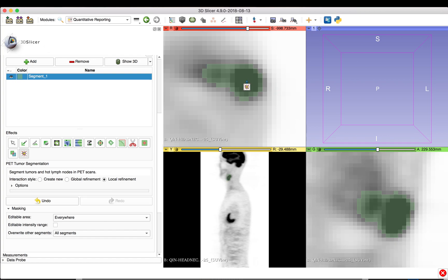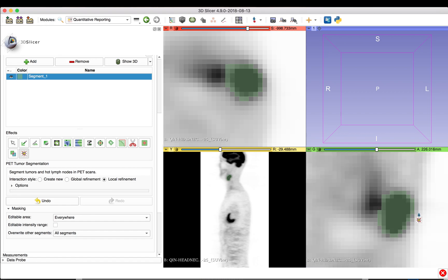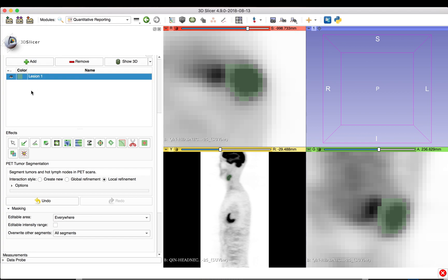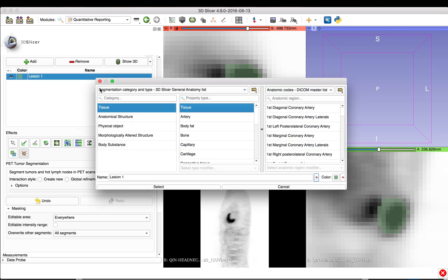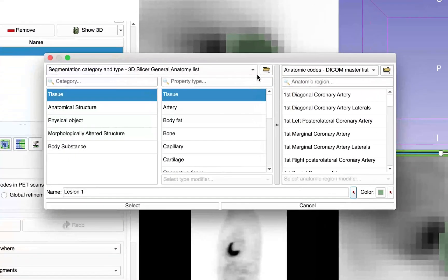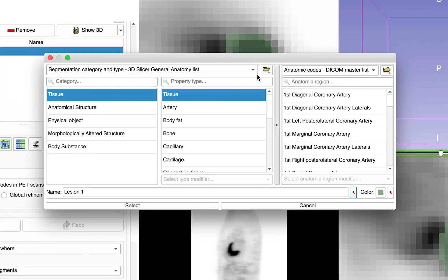For each segmented lesion, we provide a descriptive name and assign proper terminological codes. This information will be stored in the exported DICOM seg and SR files. We will name the first segmentation lesion1, and double-click on the color box to the left of the name. This opens the terminology metadata dialog box where we can assign segmentation category and type and anatomic code.